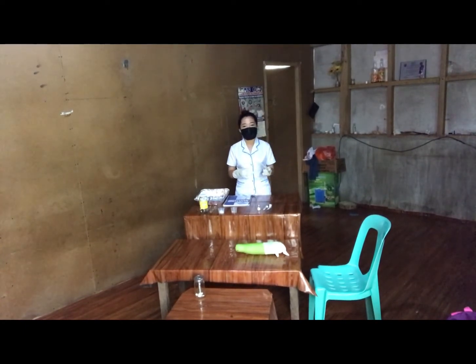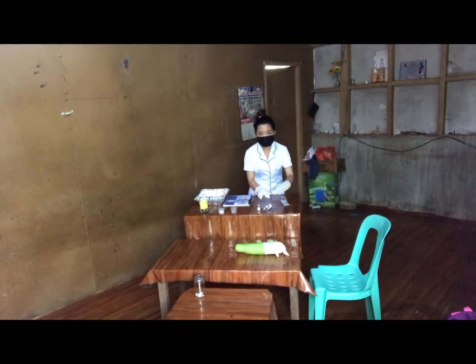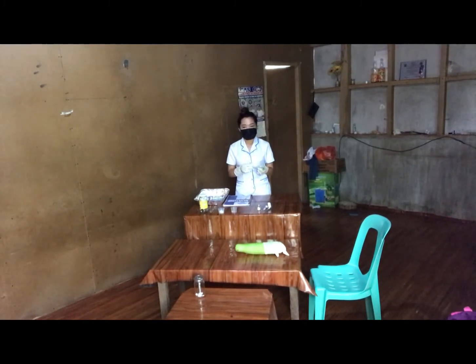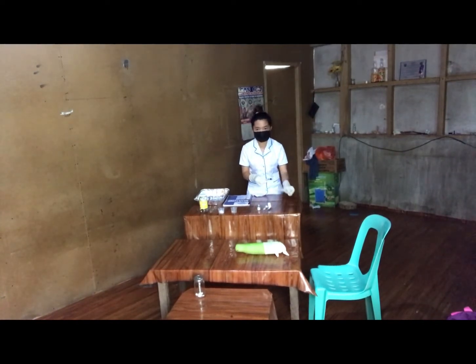Now open the aspirating needle. So I'm done opening. Now I will connect the 23 gauge syringe to the aspirating needle. So I will connect this.